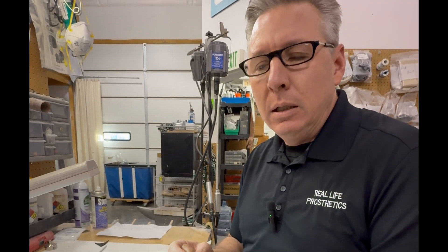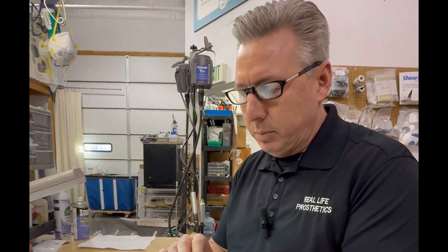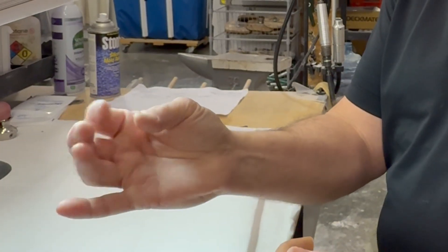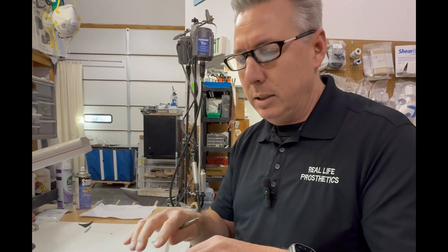Jonah Seberg, CPO with RealLife Prosthetics. We have a patient in this morning who uses an alloplastic finger for restoring biomechanical function — he does a lot of keyboarding and data entry. It's very important that with his prosthetic finger we restore full length so he has good opposition between thumb and pinky for grasping objects, using utensils, and for his keyboarding as he's coding.